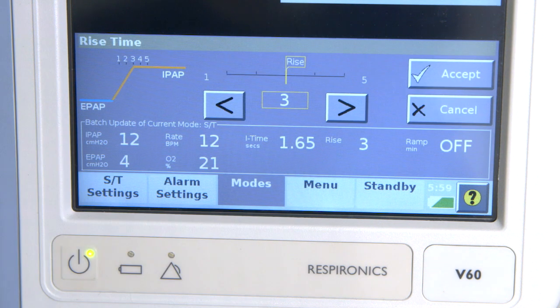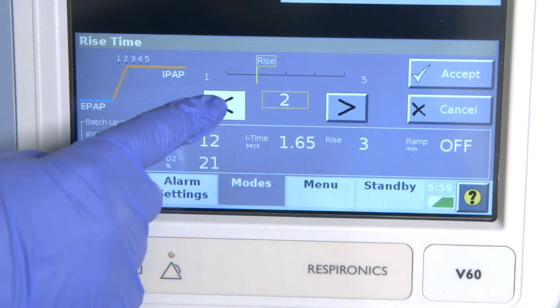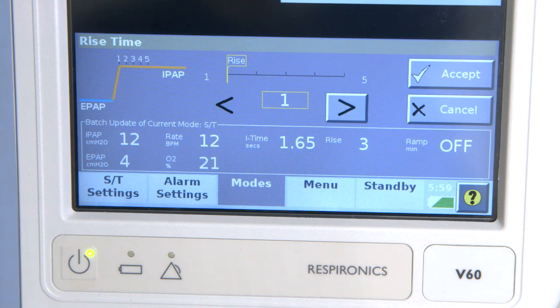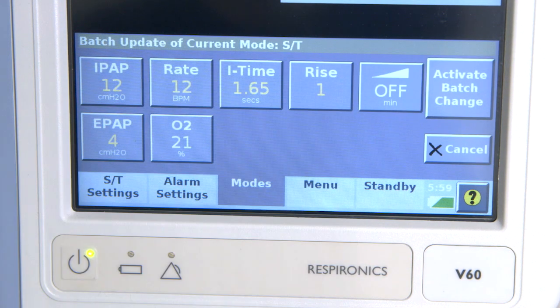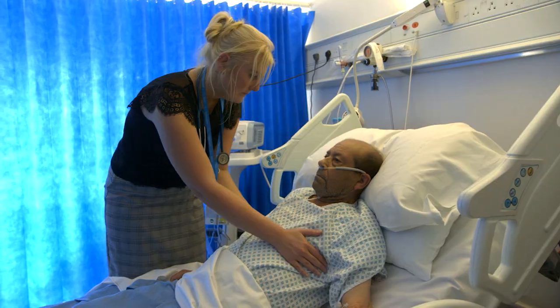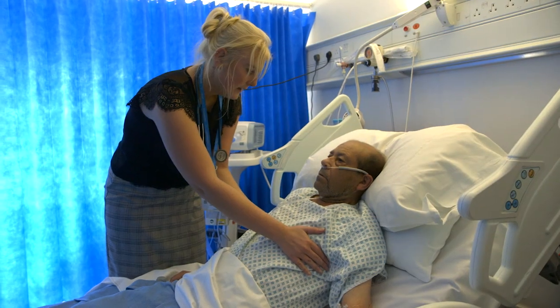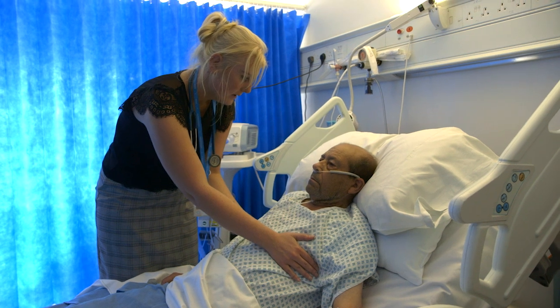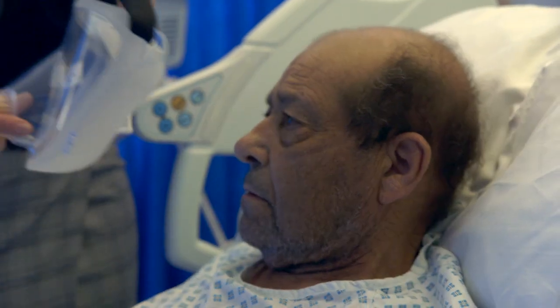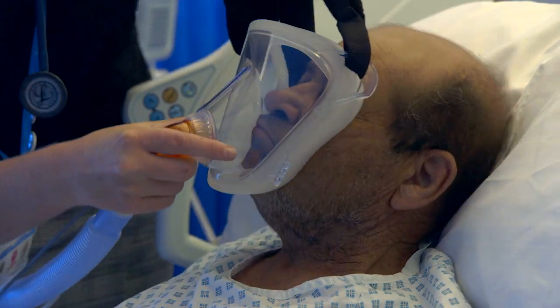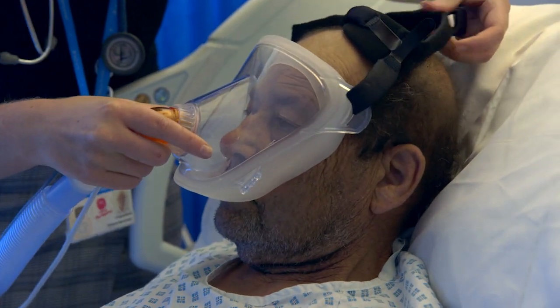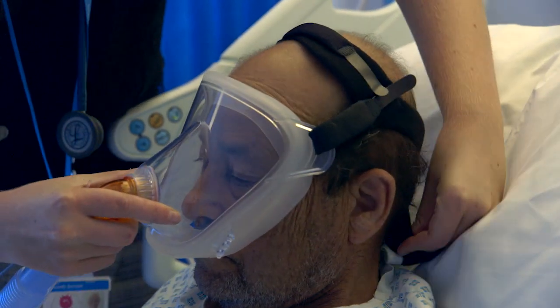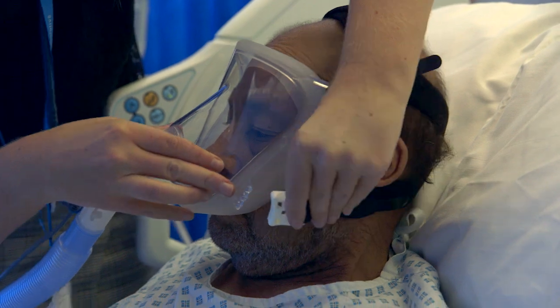The next setting is the rise time — this is how quickly we are delivering the breaths. The rise time ranges from 1 to 5, where 1 is a quick rate and 5 is slow. When setting the rise time, we tend to start at a faster rise time around 1 to 2, because patients tend to have a higher work of breathing when they initially start on NIV. Once the patient is settled on NIV, you may need to change the rise time.